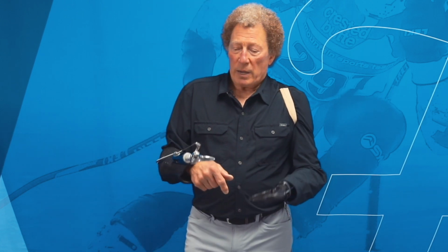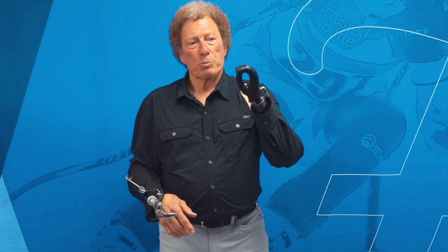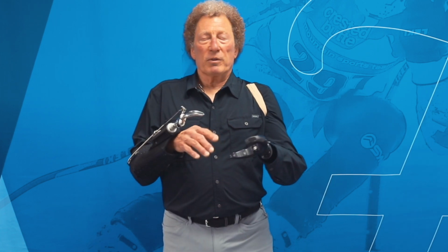Now that's one of the downsides to a split hook, that every time you open it, you have to overcome its maximum closing force. So it's not that efficient. Compared to a 90+% efficiency prehensor, these are far less efficient in that regard. They're good devices. There have been literally tens of thousands of them used throughout history, and they serve a lot of people, but they have limitations to their function.